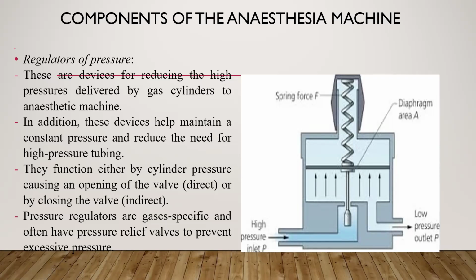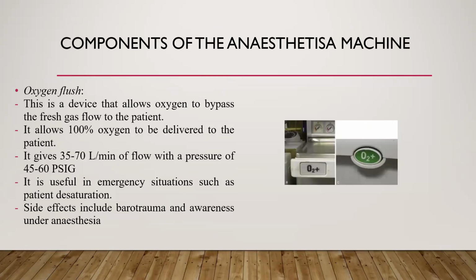This is very important because without it, you have barotrauma, both to equipment, and you can imagine if this pressure is delivered to the patient's upper airway.